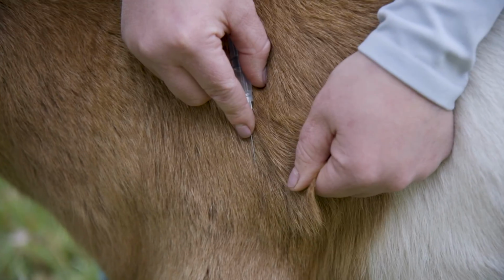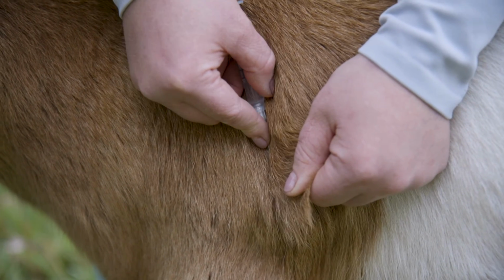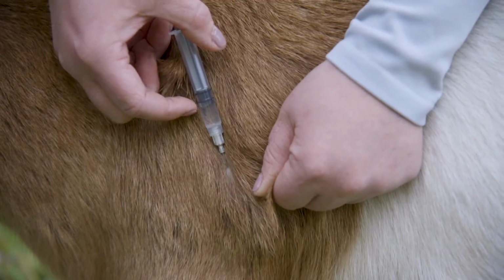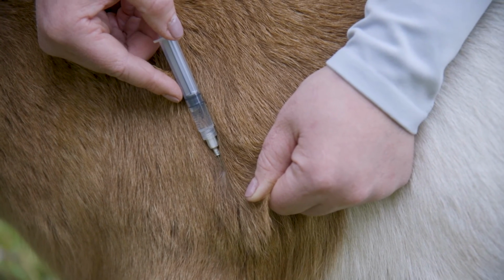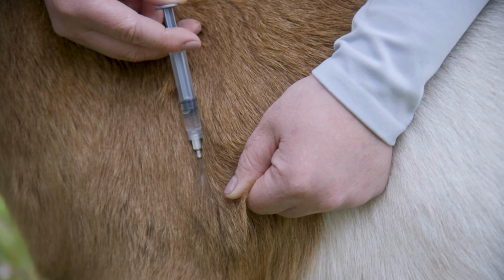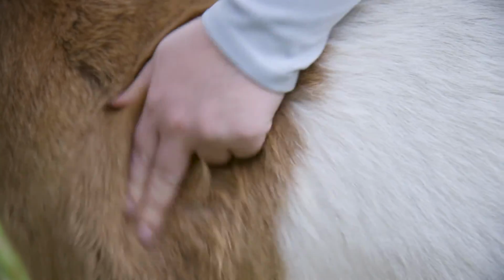So I'm going to be parallel to the goat, almost right next to the skin, and I'm going to go right underneath the skin like so. If you do it that way, where you're using a sharp needle, you're under the skin, you're pulling it away, and you're also sliding it in right next to the goat, they're going to feel very little, and you're going to have little reaction. You want to pull back, make sure there's no blood, and then give the medication. Once you're done, pull out, give it a little rub, and you're good to go.